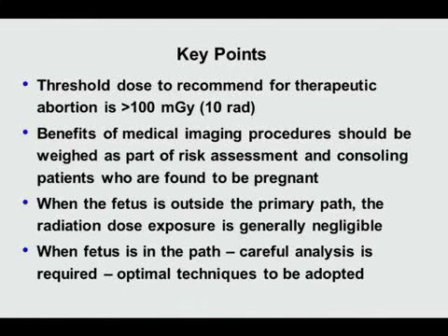For example, a lot of the time when a pregnant patient is brought in for a coronary angiography or cath procedure, the question I often get is, what should we do about this patient? My suggestion is to try to minimize the exposure where the physician enters the catheter through the femoral artery to insert it all the way to the heart area. If they can minimize the exposure during the fetal area, that's only a few seconds of exposure, and the radiation exposure to the fetus is quite minimal. These are some of the steps. If we discuss with our physician, they feel more comfortable doing this patient. As long as the benefit of the procedure far outweighs the risk, the fetal exposure for most imaging procedures is quite low.